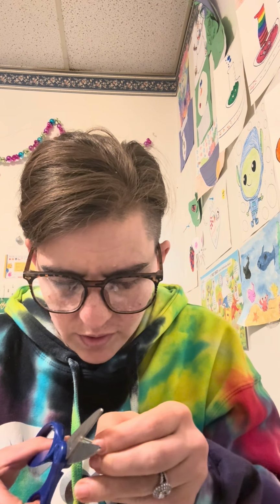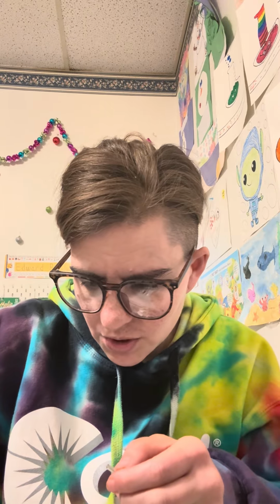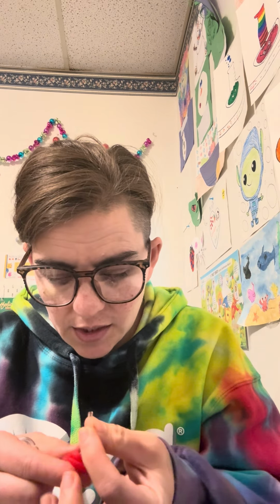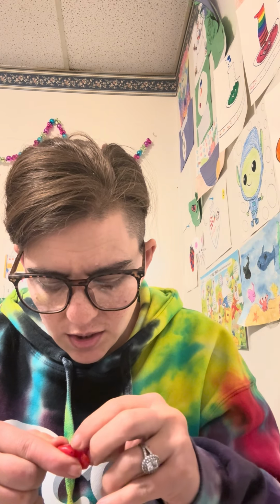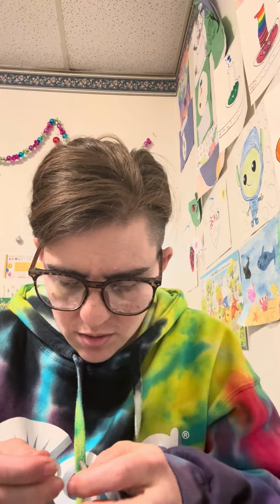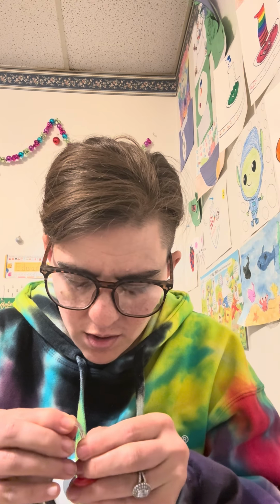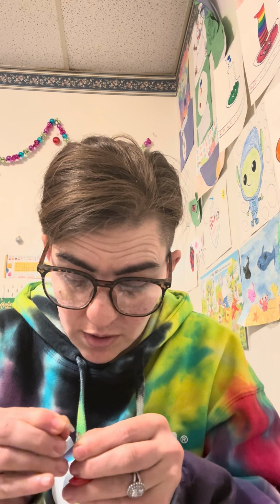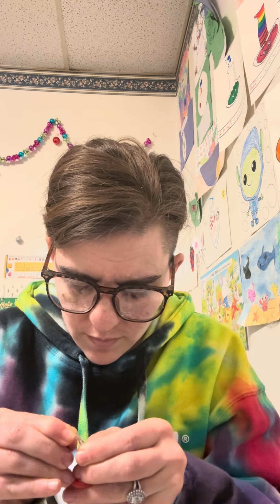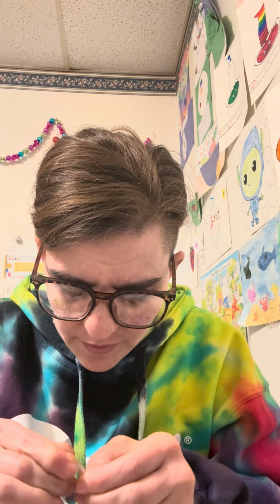I'm doing this in real time so that anybody who's watching can see exactly how long it's going to take to change your hearing aid tubing for your BTE. If you've never done it, this is exactly how long it takes. Now I can do it super fast because I've done this so many times, and now I don't have to struggle because I have the tube puller.